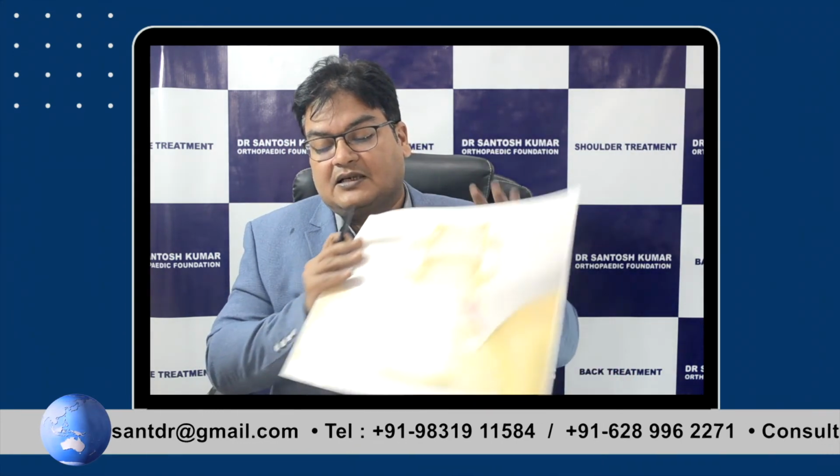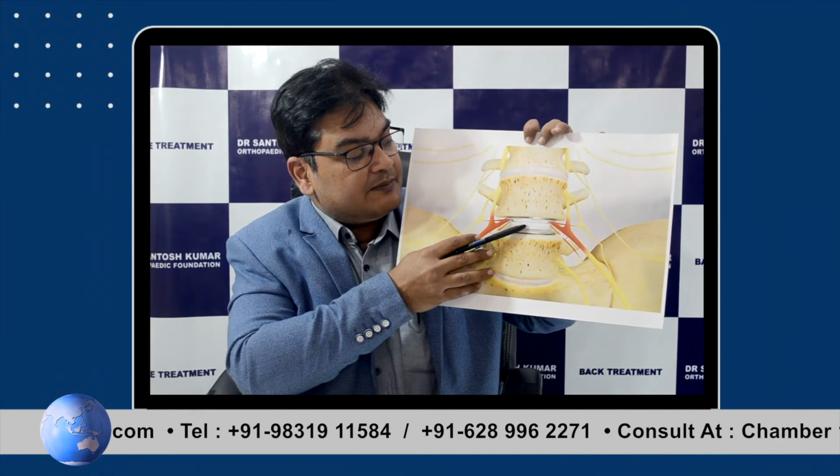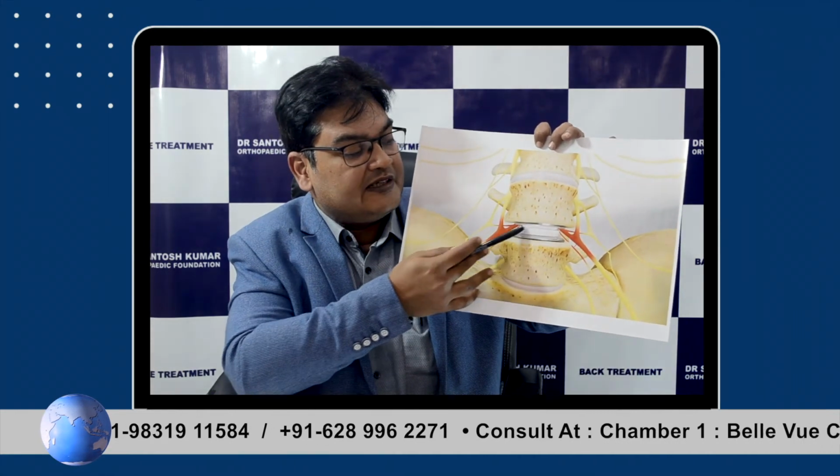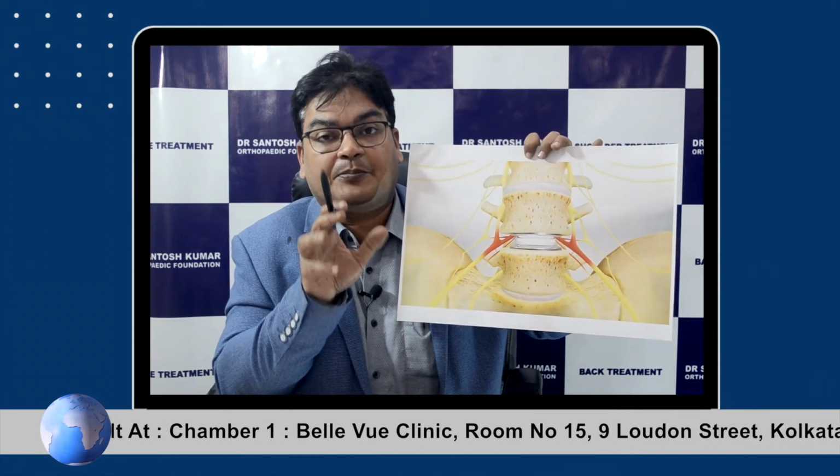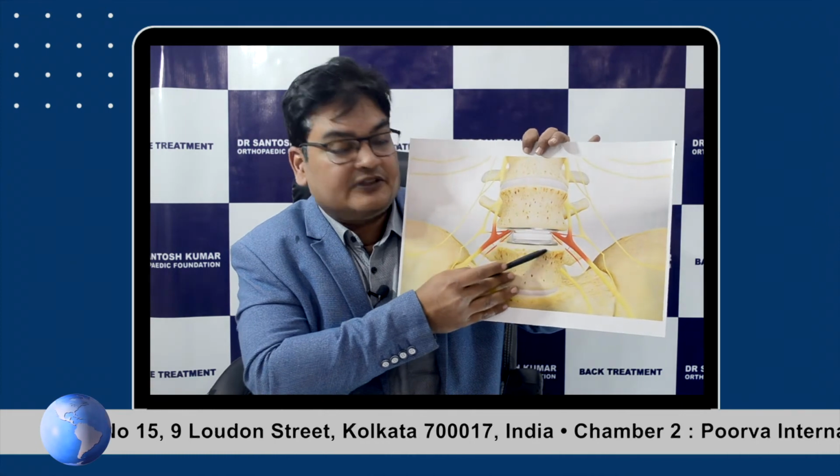To summarize, what we do in disc replacement, we remove the diseased disc which was impinging upon the nerve root, encroaching the neural foramen and causing severe pain. We replace that degenerated or protruded disc with a disc replacement implant, which is known as artificial disc or disc arthroplasty.